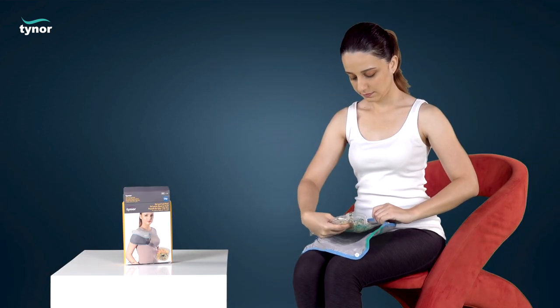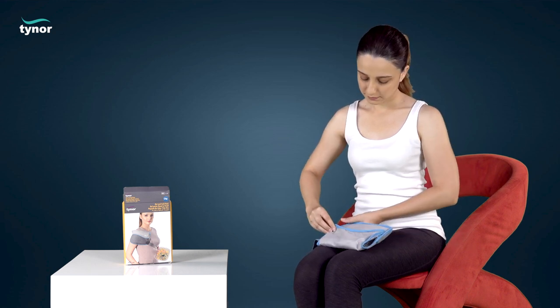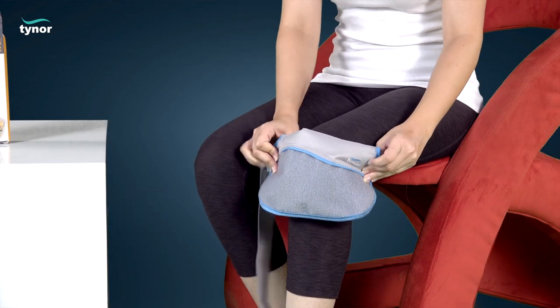Now put the hot and cold pack back in its pouch to use. Place the hot and cold pack on the affected body part.